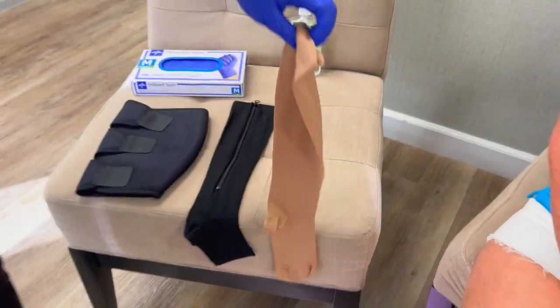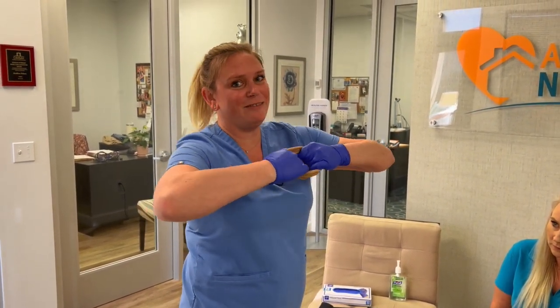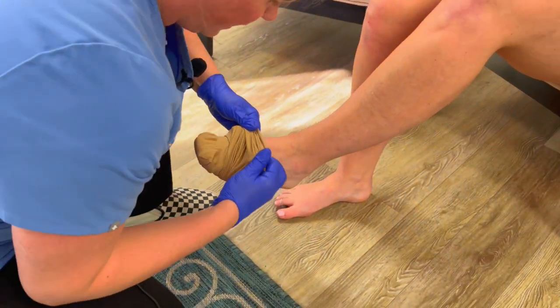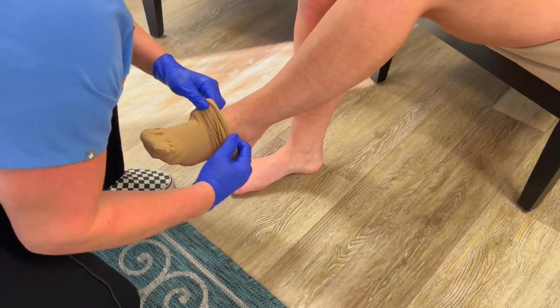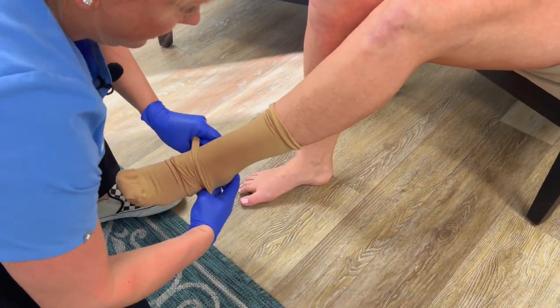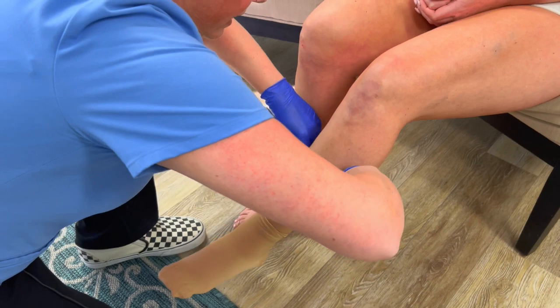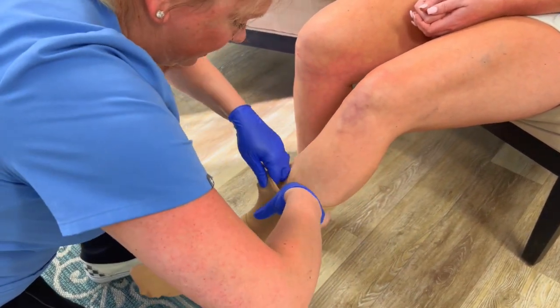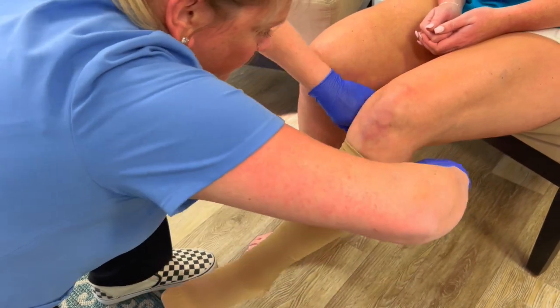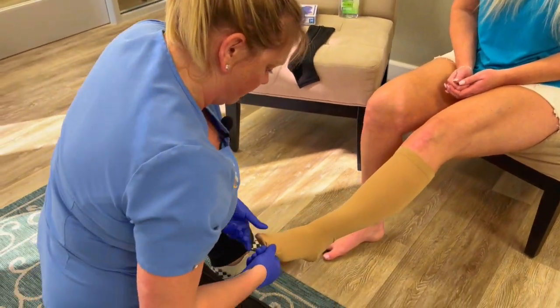We're going to start with our traditional stretchy compression stocking. You want to kind of cinch it all up — they are quite tight, so you really have to use your muscles here. Then we're going to start at the toes and gently slide it up. The hardest part is getting it over the ankle; once you get the ankle, you can slide up. You have to be very careful not to tear your client's skin or cause any injuries. Finally, you want to smooth it and get rid of any creases or folds, and make sure that the toes have room.